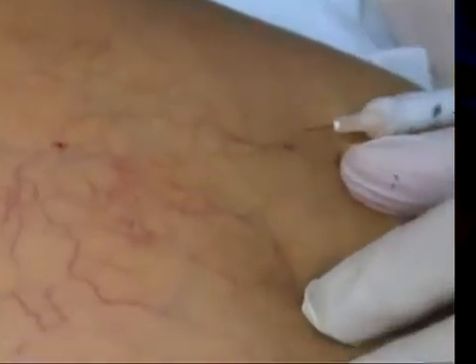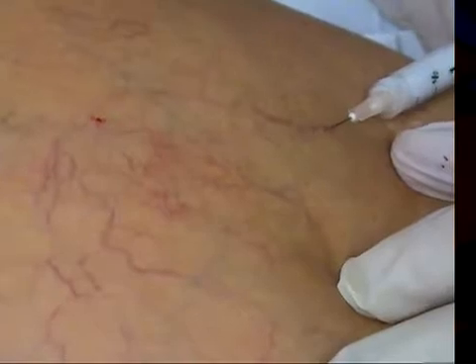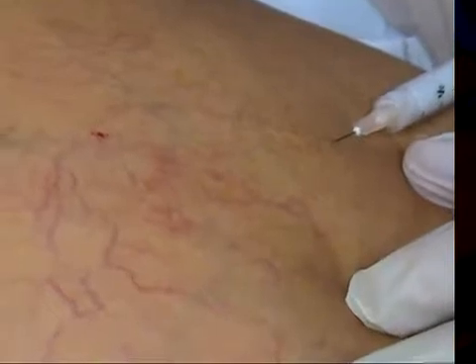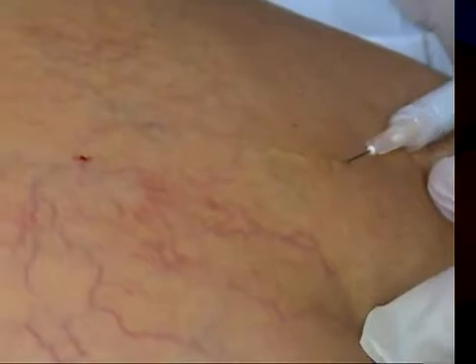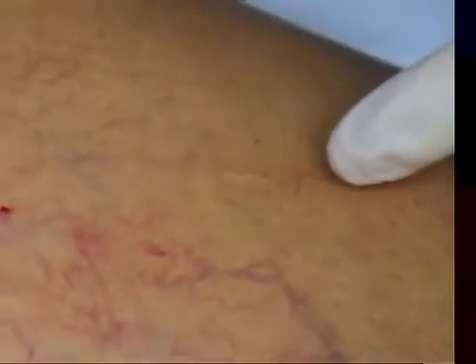Always want to try and inject uphill. Here we go again — one needle coming in. Just that foam gradually working its way up. Now this foam is under a lot more pressure than if we were just injecting 0.1% sodium tetradecyl. It doesn't want to go too far, but if you look at that white area — you see it's staying white for a lot longer than if you just put in the regular sclerosing agent.